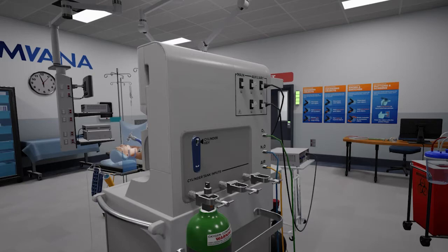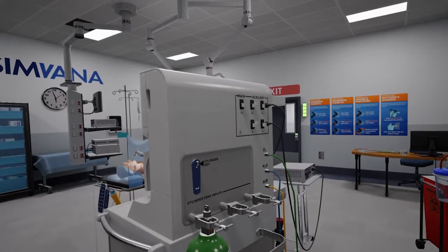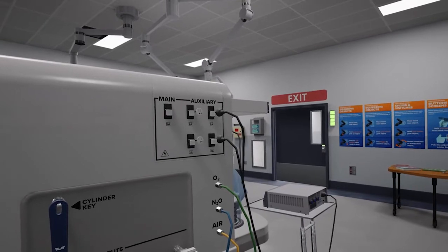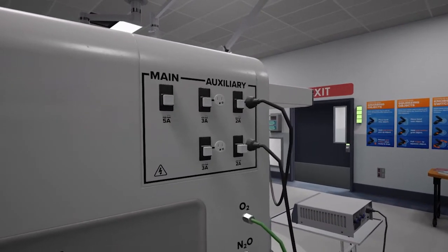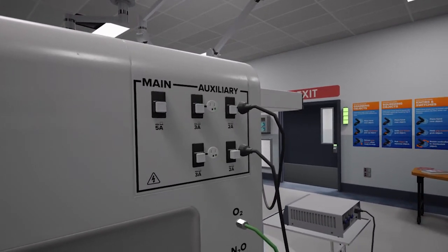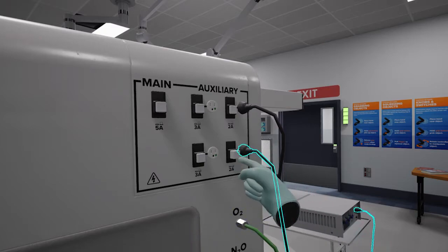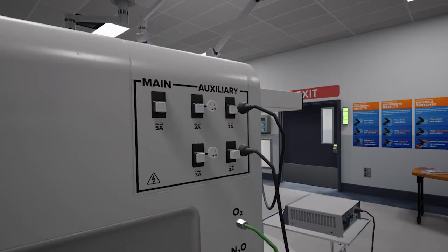We are looking at the back of the anesthesia machine and as you can see we have a case in progress, but what I would like you to look at is the auxiliary electrical outlets on the back of the machine here. One of the outlets, the circuit breaker, is tripped and I can't re-engage it.